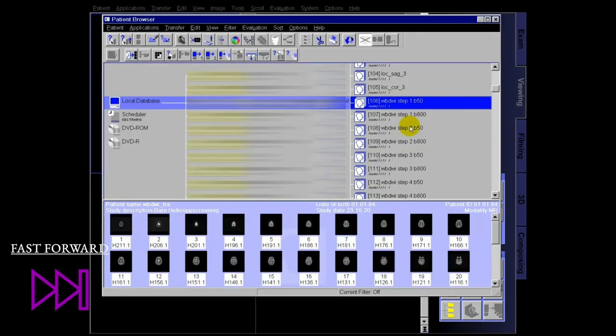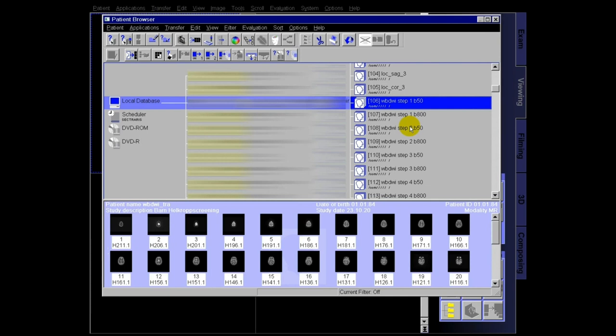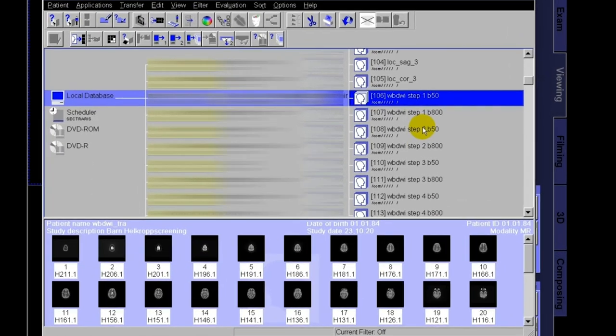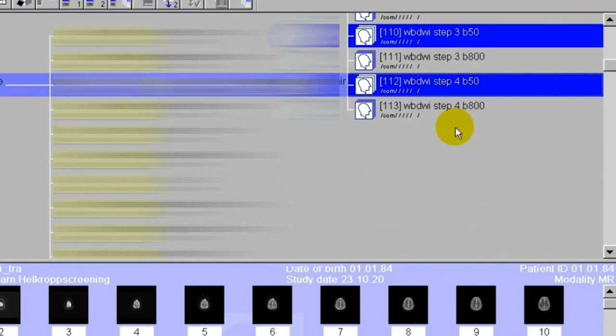I've already split everything for you, so all you have to do is split steps three and four the same way. What you have in front of you now are the manually split series — b50 in four steps and b800 in four steps.